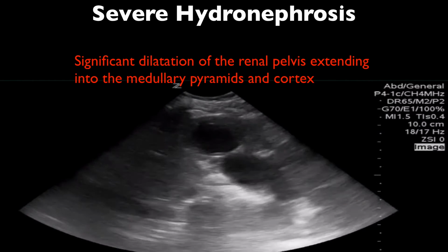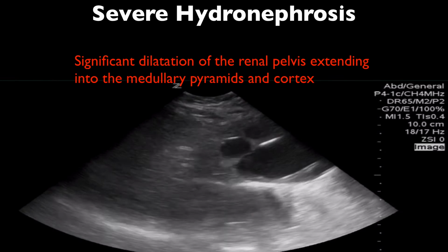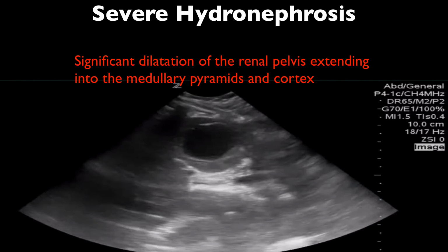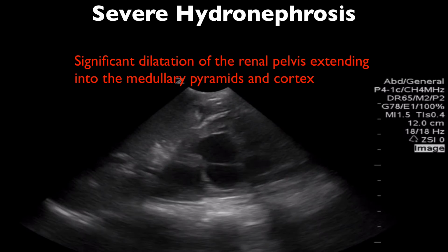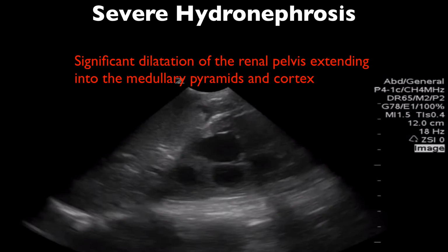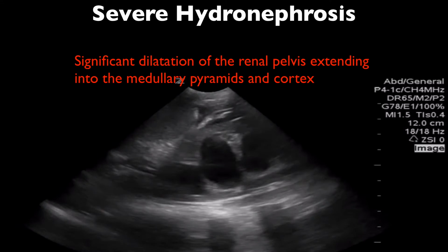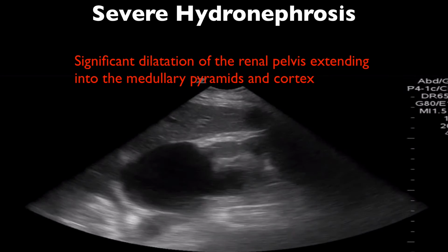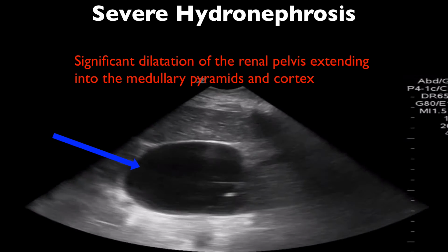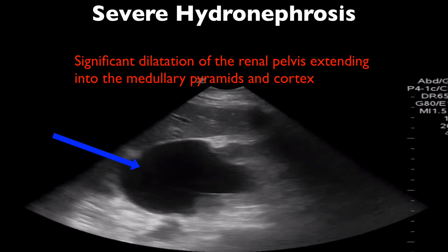Compare that to severe hydronephrosis, where the fluid extends well into the kidney, medulla, and cortex, and seems to be compressing all the structures. The regular architecture of the kidney is just completely destroyed, and it's sometimes difficult to know exactly what you're looking at. You can now understand why the function of the kidney can decrease with prolonged periods of hydronephrosis. This video clip is interesting in that there is severe hydronephrosis as well as a large peripheral renal cyst. We will re-demonstrate cysts in just a few seconds.